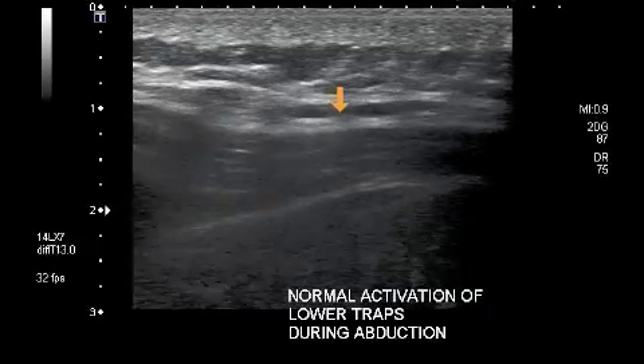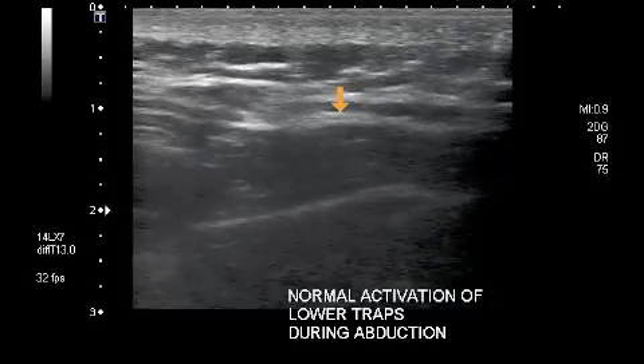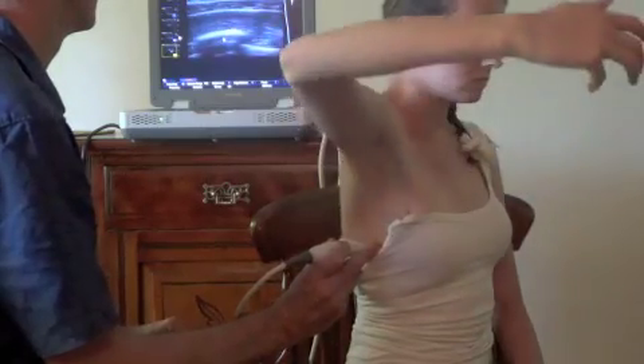Again, with correct scapular positioning, better activation can be achieved. The level of serratus anterior muscle activity can also be assessed during functional movements.